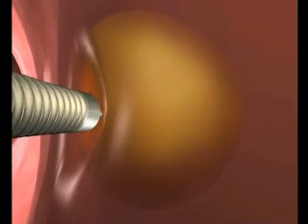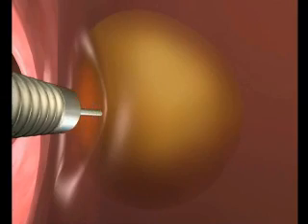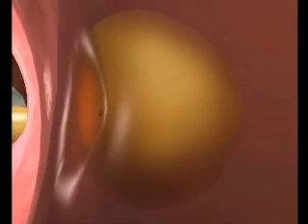The physician positions the tip of the steerable navigation catheter or locatable guide via the CT images and creates a small dent at the lymph node entry point. The cytology or histology needle can then be inserted into the lymph node and sample collection completed.